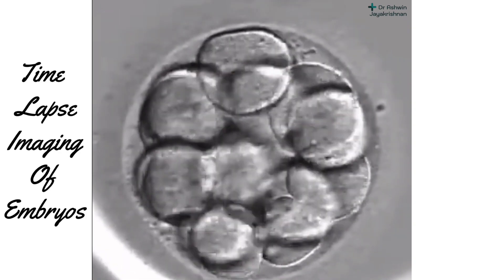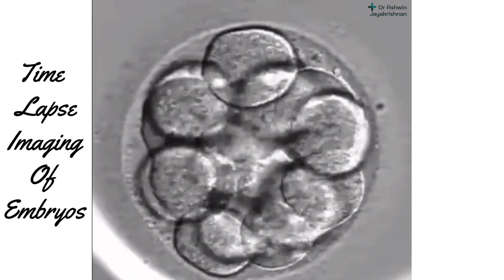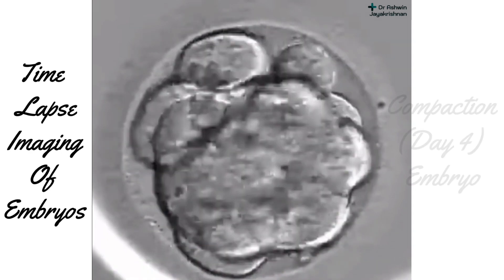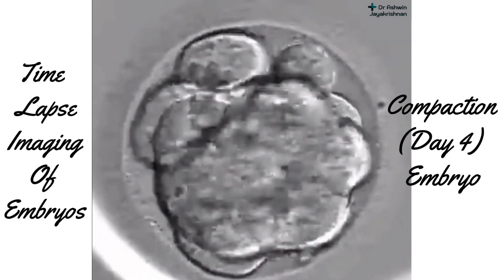Day four is around the compaction stage, which means all the individual cells combine together to form a uniform embryo.